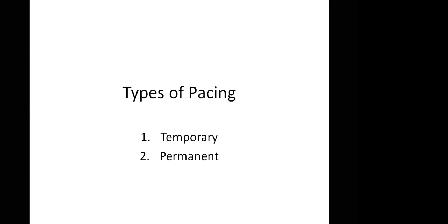Yes. So those two, it's because I've seen it before. That's what I'm trying to describe, what it means. So the first two you see is A. They wrote in between the two dots is A. A means atrium. In between the second two dots, you see a V. I'm sure you can see the V. Yes, sir. It means ventricle.